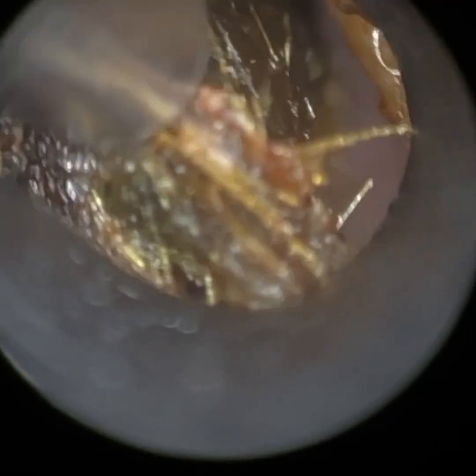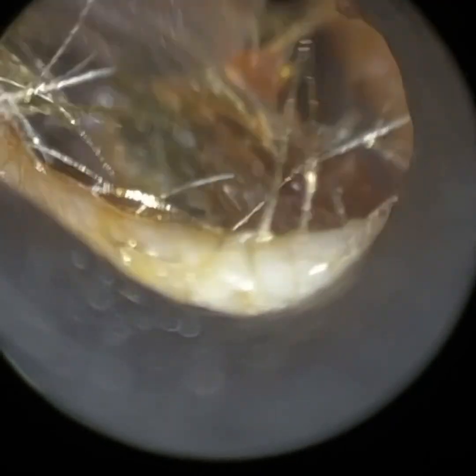I'm just using the Zolnir Suction Probe just to detach this matted wax off the floor of the ear canal. This extends from the entrance all the way to the eardrum, and we're just using the speculum to dilate the ear canal.